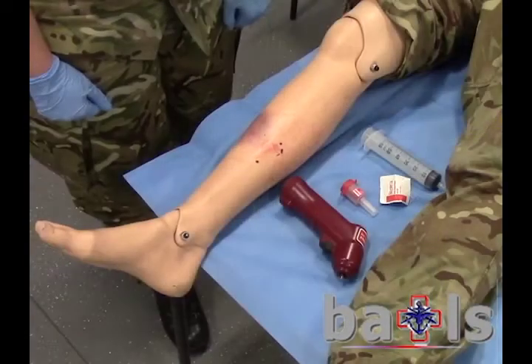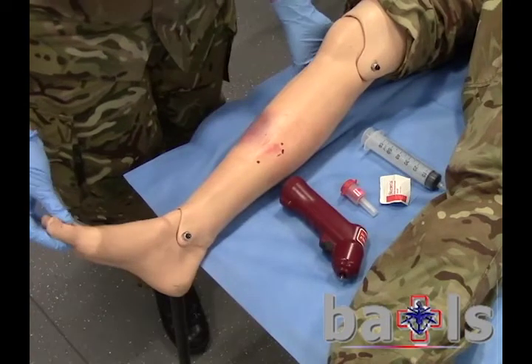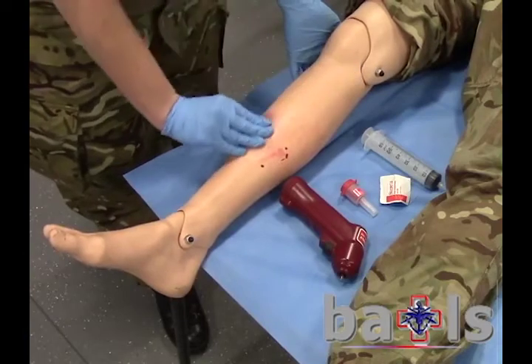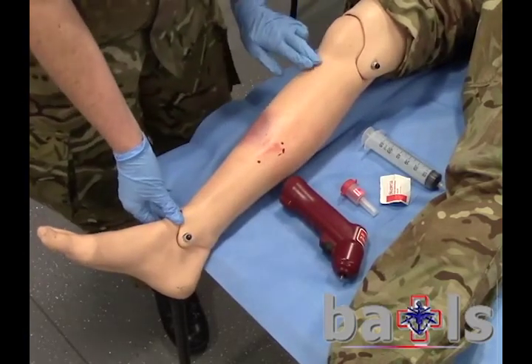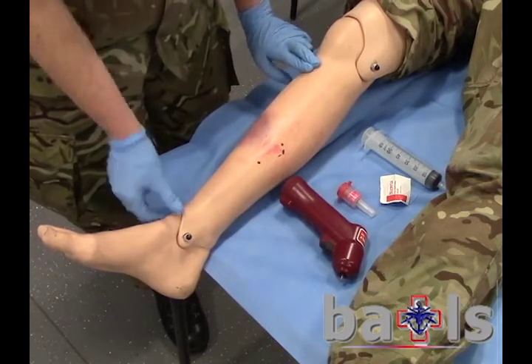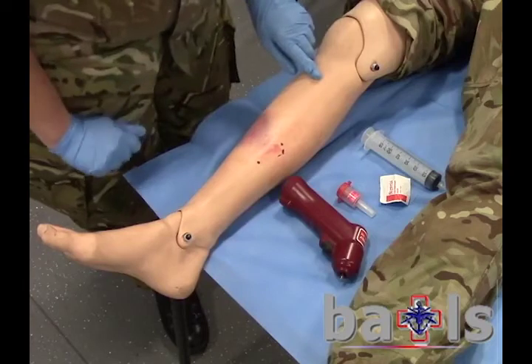Always remember to brief your casualty before attempting IO access. At the selected site, check for evidence of injuries that might contraindicate use of an IO device. Measure to determine the drill location and clean the area with an alcohol swab.